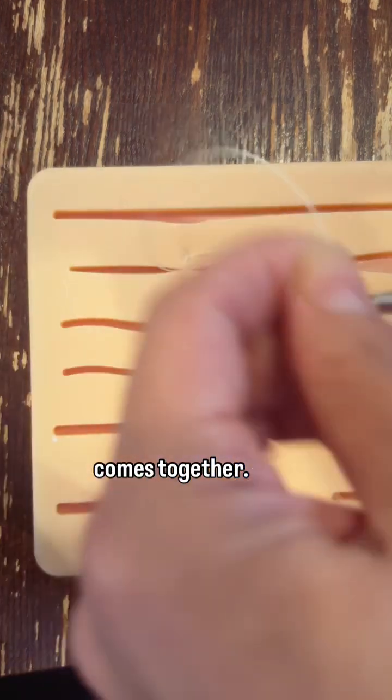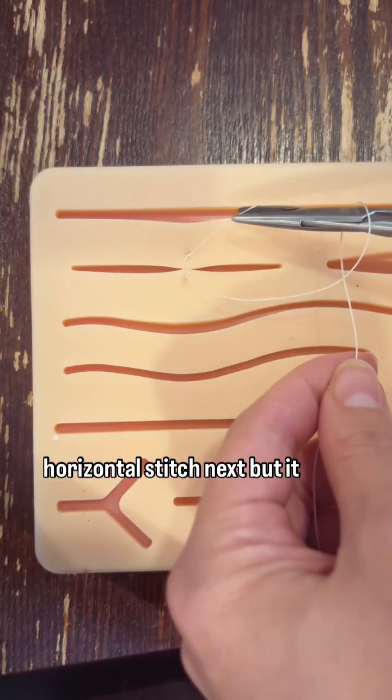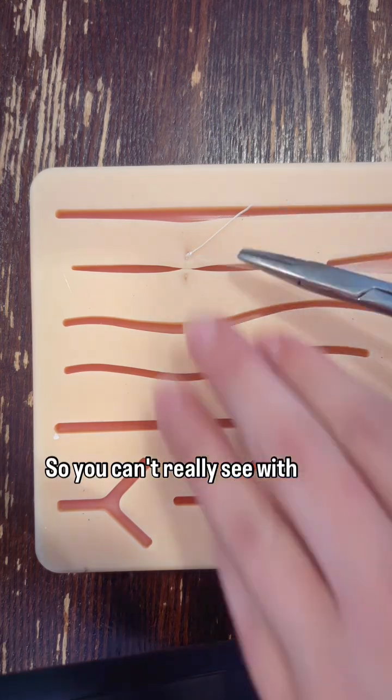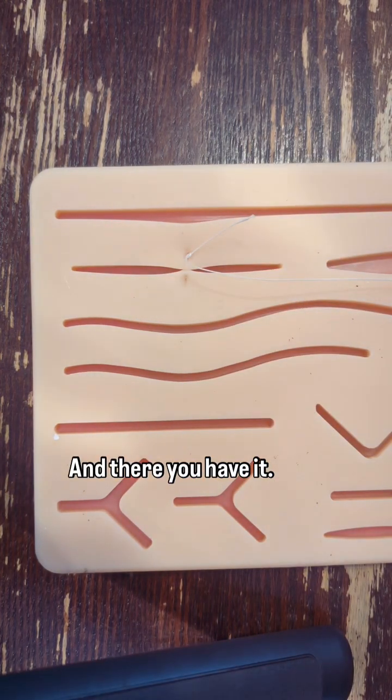The horizontal - think of an H - we'll do the horizontal stitch next. It actually looks more of an H, while the vertical is a straight line. You can't really see with the silicone, but the edges are everted. There you have it.